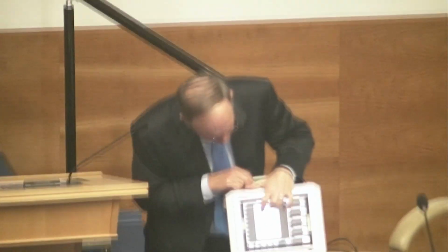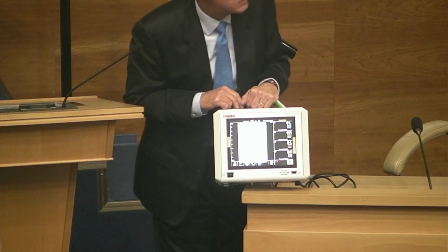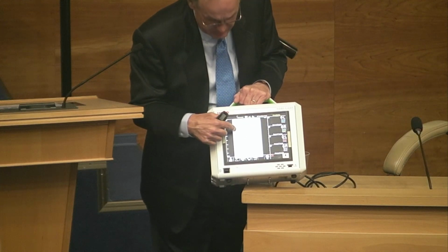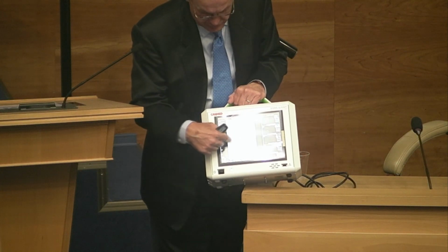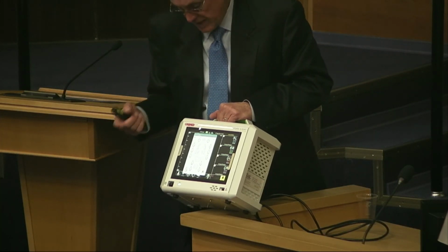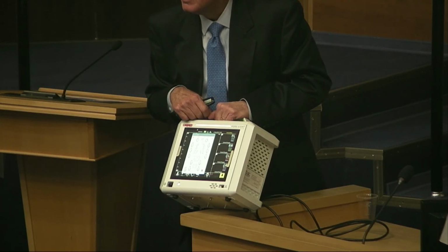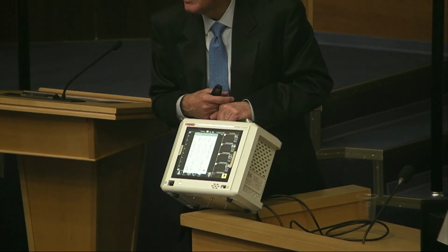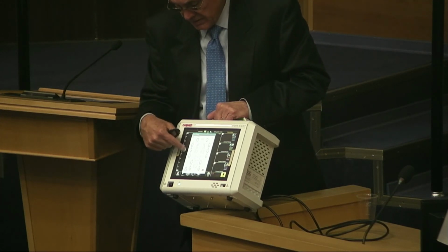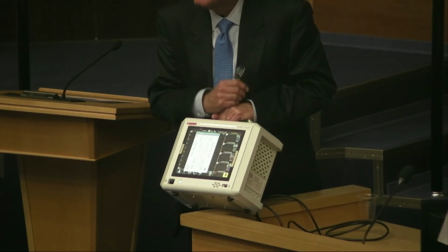There are 4 channels on the monitor, and that diagram comes up, and you just touch whichever spot you want to monitor. So with a muscle flap, you could use either a deltoid muscle or an arm muscle, because that's the tissue that you're basically looking at. And then it automatically programs that channel for that sensor.